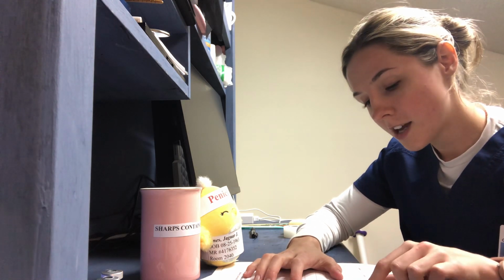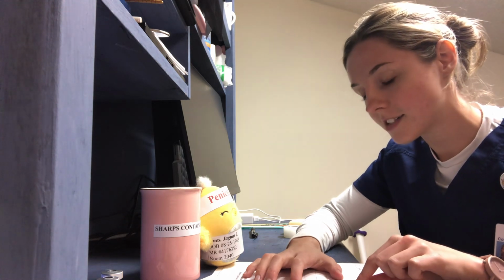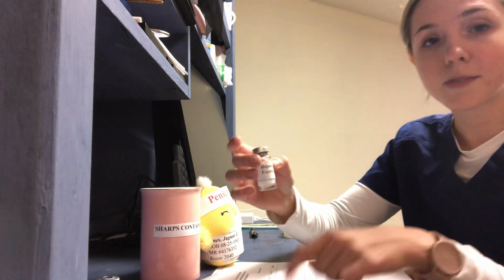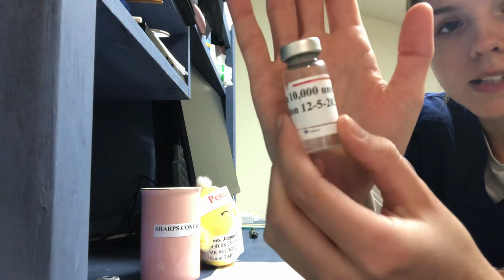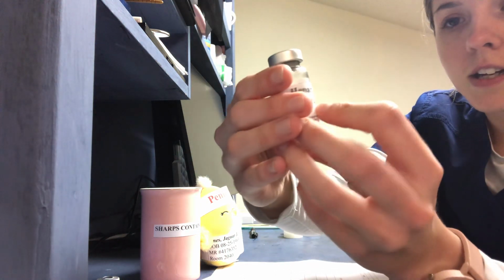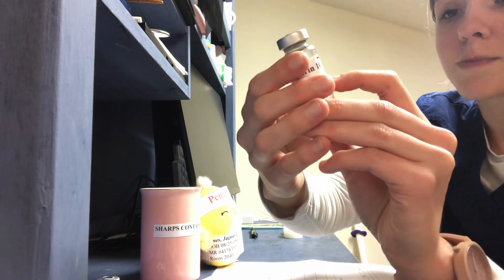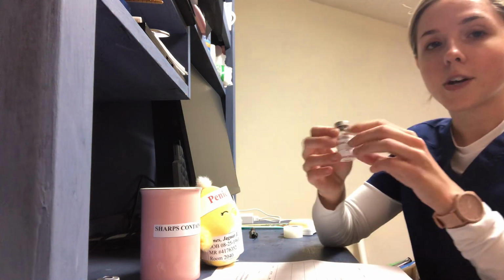Jaguar Jones, medical record number 4176352, date of birth 8/25/1963. I want to get the right medication, so I have heparin here. I'm selecting the right medication. Heparin, 10,000 units per milliliter. I have heparin here, 10,000 units per milliliter. The medication is in date. It expires December of next year, 12/5/2025. So that is good.